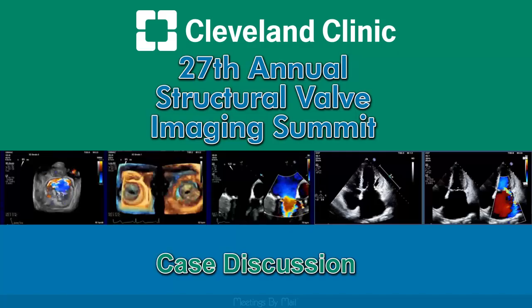Just so you know, this is not like a PVL. It's very easy. The hole is flat, planar, right in front of you. It's not serpiginous. You're not challenged to get a wire across. It falls across. It's actually very easy, because it's not like a PVL. Well, I'm taking from this as a non-interventionalist that there's more than one way to do this successfully in the right hands, and I will add to that with ideal imaging.